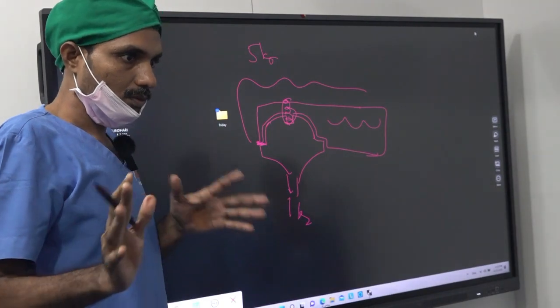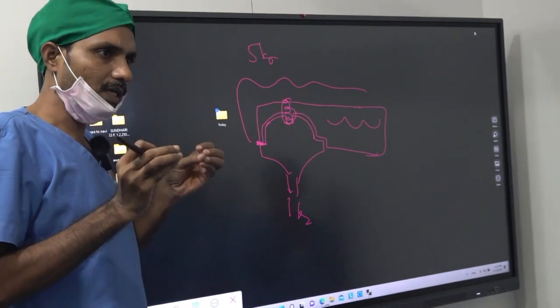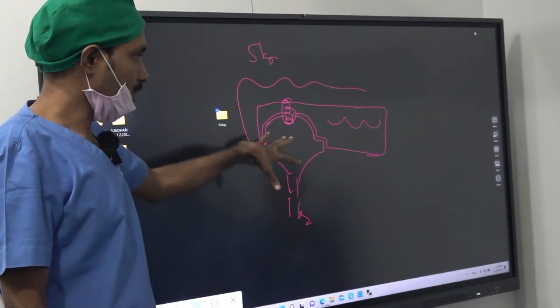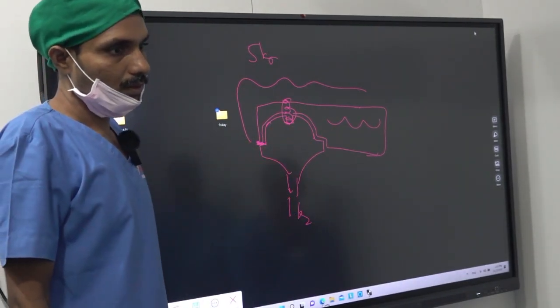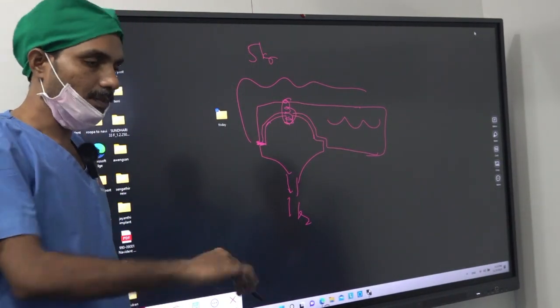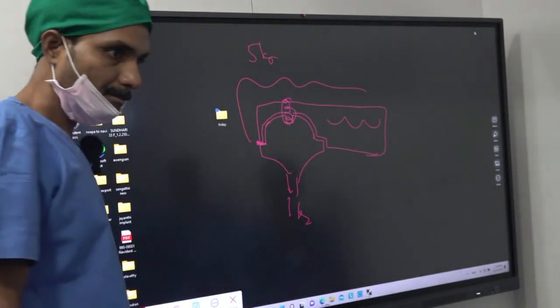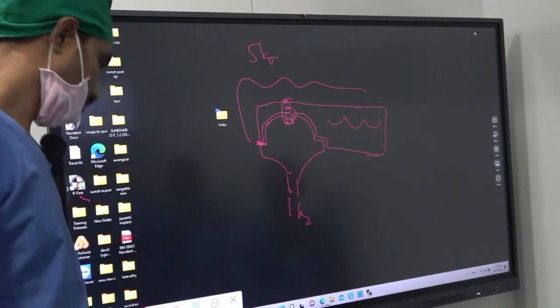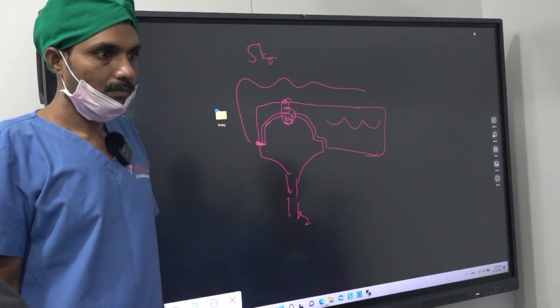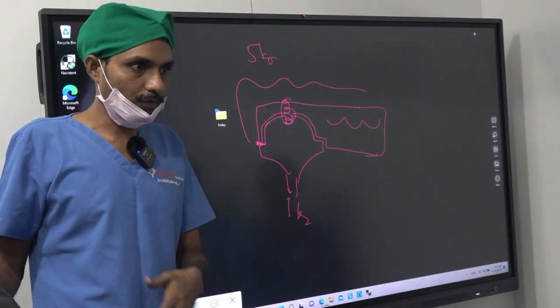So difficult cases, challenging cases, where inter-implant distance is more, very little bone cases, we are using this multi-unit. In conventional also, this multi-unit is happening. We are using that single piece multi-unit. Single piece multi-unit. And the titanium bar they are constructing that. Yes, they will do that. Also show the acrylic, metallic bar. The prosthetic segment will come after that.